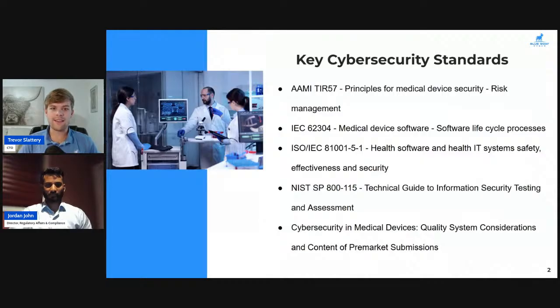Next, we're looking at IEC 62304, medical device software lifecycle processes. This talks about the development flow for ensuring that we're designing safe and secure medical device software. Very similar standard is ISO IEC 81001-5-1, health software and health IT system safety, effectiveness, and security. This talks a little bit more about the controls and implementation based on the life cycle.